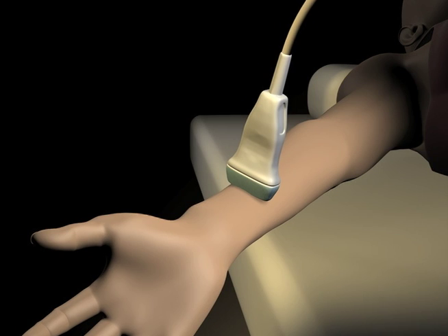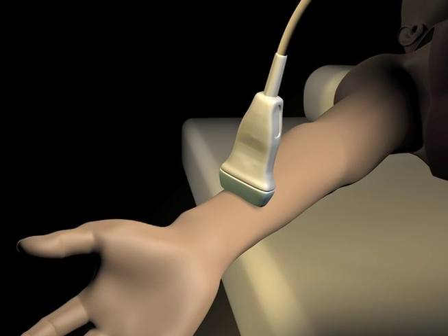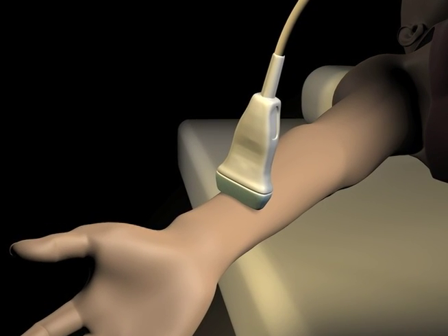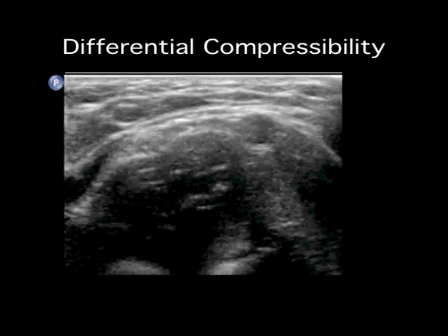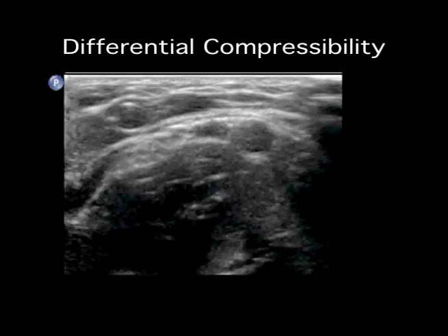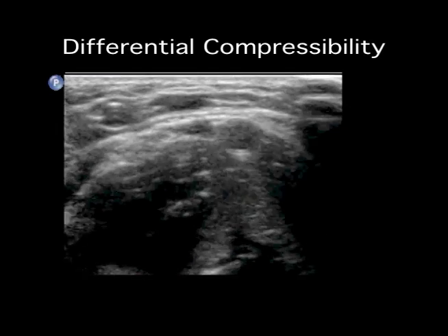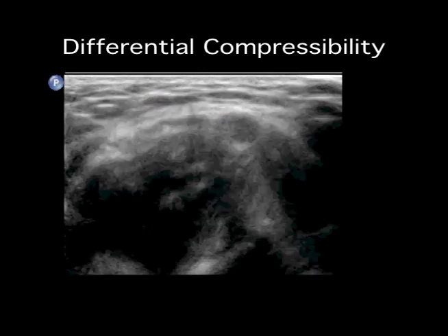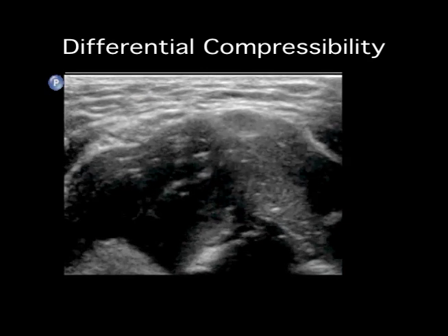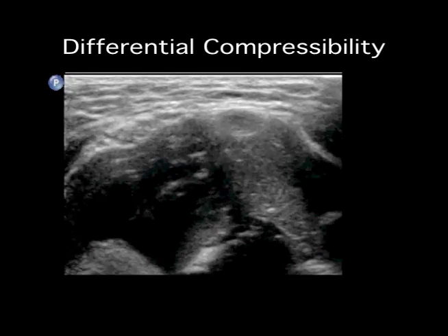Ultrasound can be used to identify the radial artery anywhere along its course in the forearm. This sonogram of the antecubital fossa demonstrates the difference in sonographic appearance of arteries and veins. Veins are easily compressible, and arteries are less compressible and pulsatile.